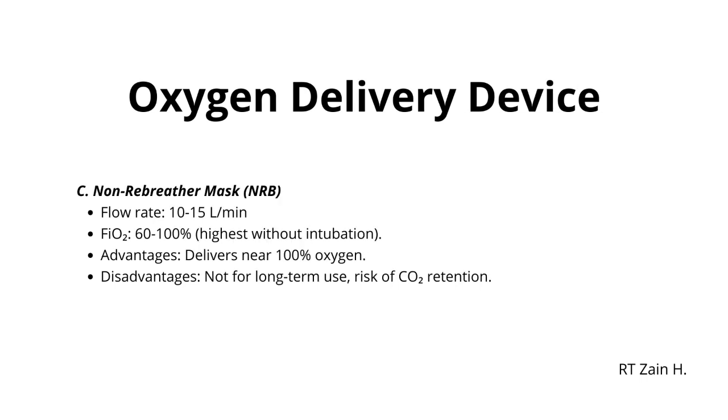C. Non-rebreather mask, NRB. Flow rate, 10 to 15 liters per minute. FiO2, 60 to 100%, highest without intubation. Advantages: delivers near 100% oxygen. Disadvantages: not for long-term use, risk of CO2 retention.